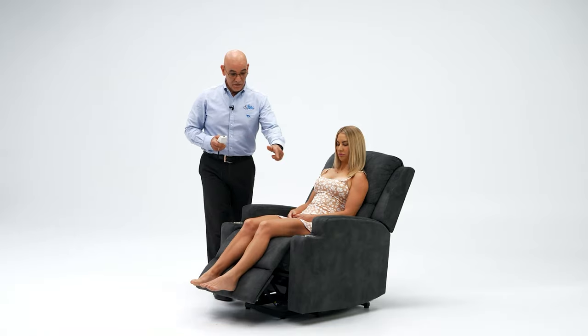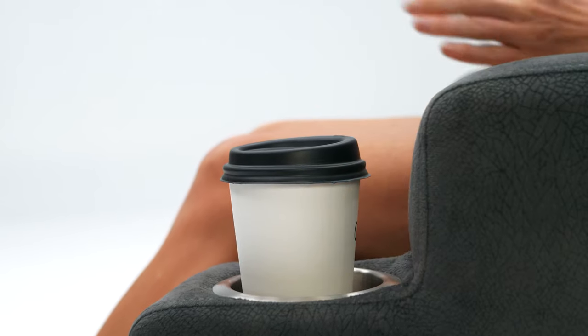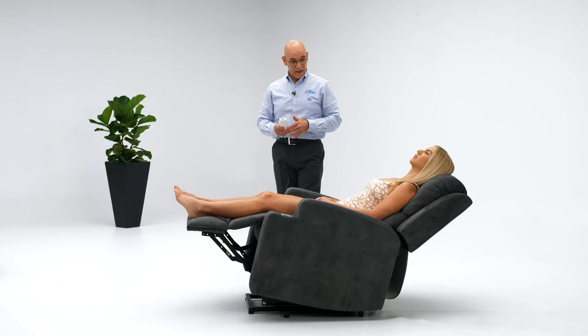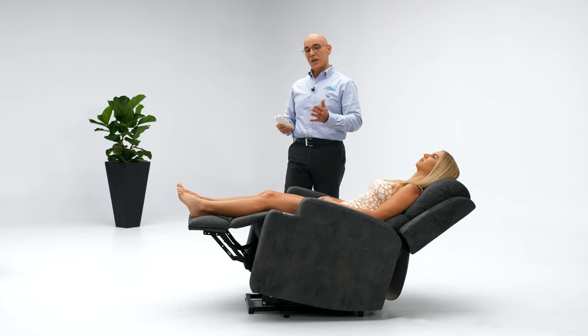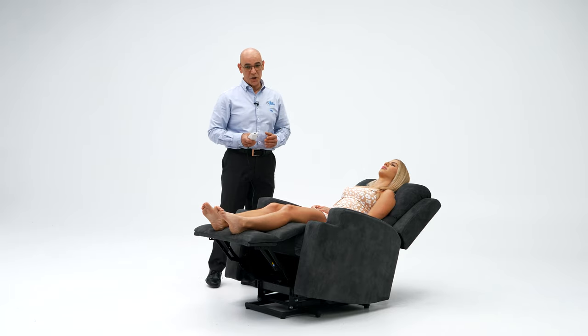It comes with two very convenient cup holders so you can have a cup of tea or glass of water next to you. It also has a side pocket for remote storage and a battery backup system, so in case of any power outage you will have sufficient power to at least get out of the chair and you won't get stuck in a recline position.